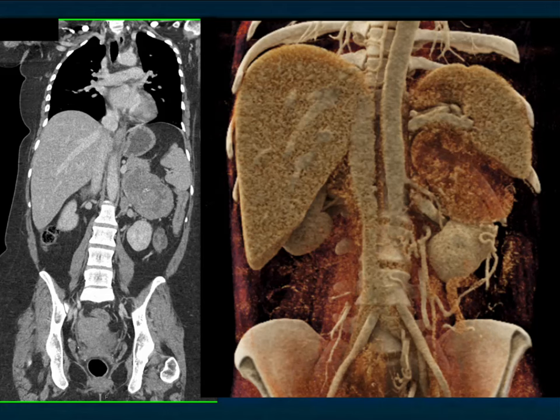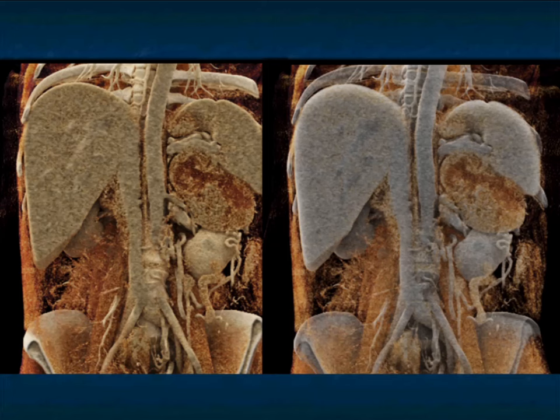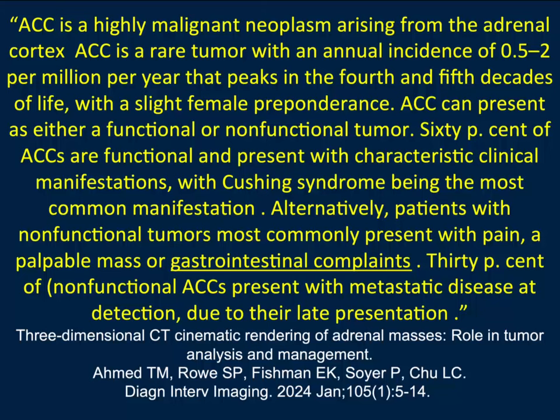On cinematic rendering, the redder area is necrosis. Cinematic rendering is very good at creating texture maps showing how the liver, spleen, and adrenal look differently. One of the things we're trying to do is see if we can learn more about tumors based on their signature with cinematic rendering, which is nicely illustrated here.